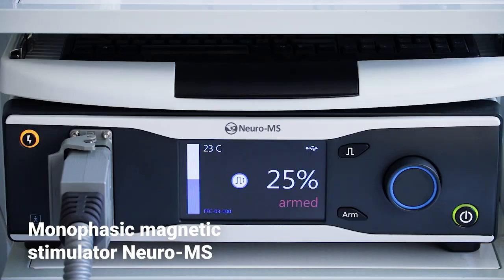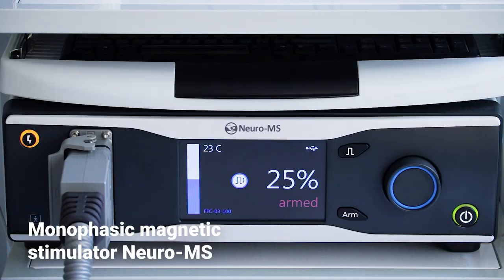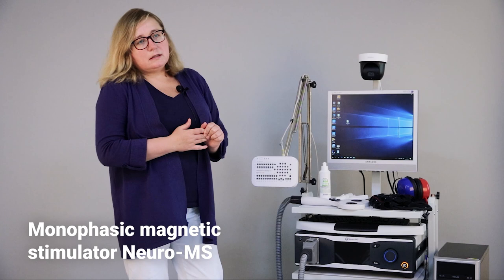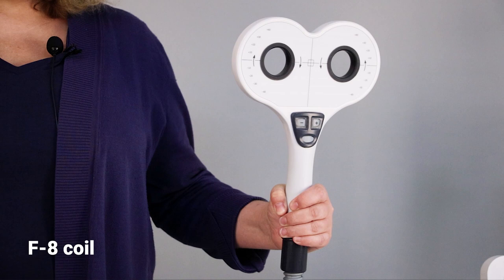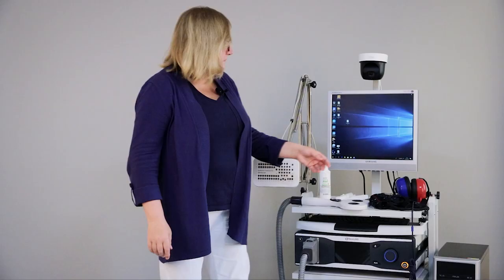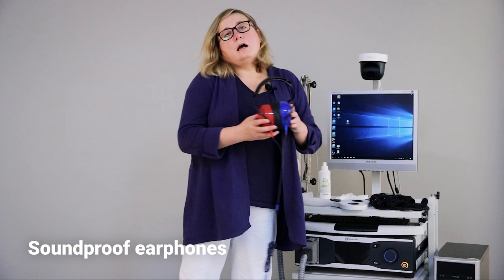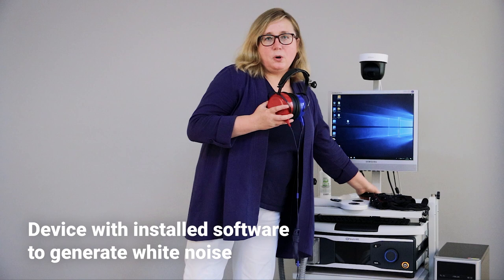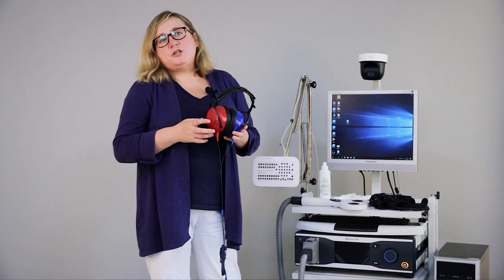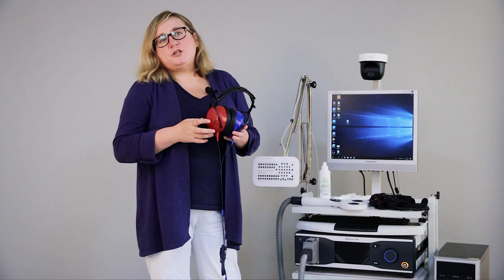Also, we will use a monophasic magnetic stimulator Neura-MS to evoke transcranial evoked potentials, and a figure-of-eight coil. I will use soundproof earphones connected to my iPhone with special software to generate white noise, because we need to avoid contamination of EEG by auditory response.